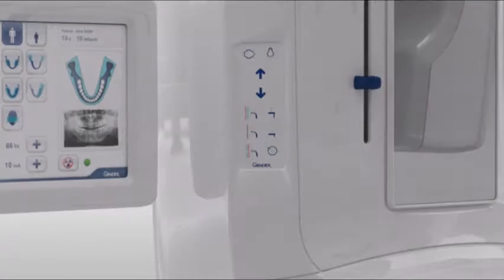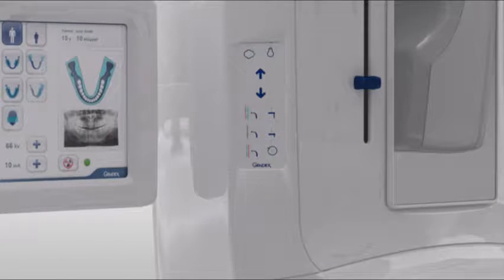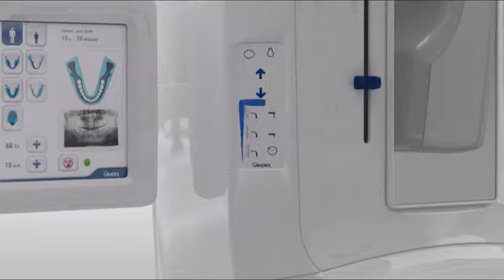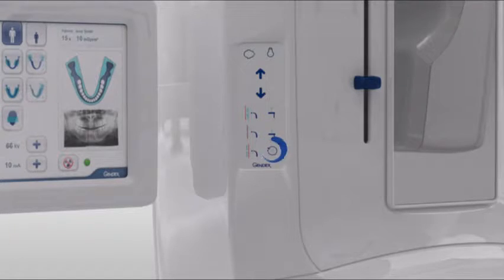The column control has buttons for patient in, laser alignment lights, carriage up and down, anterior-posterior movement, chin rest up and down, and finally a reset button.